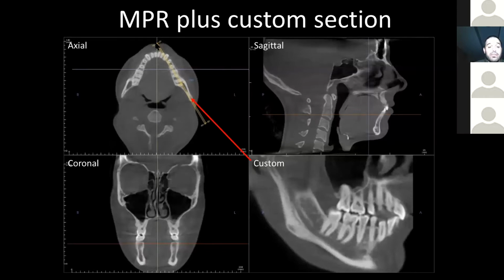Again, my principle: if you're lost, use the crosshairs. If I want to know where this slice is, it turns out it's the exact middle yellow line in this triplet of three lines in this particular software. It exactly references it. And then dynamically in the software, I can pick this line up and move it around, and this slice will update accordingly.